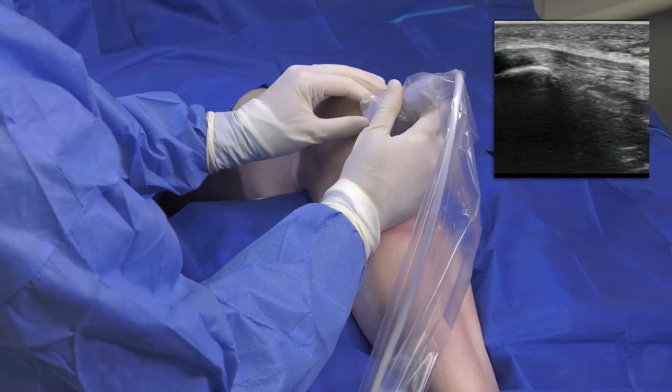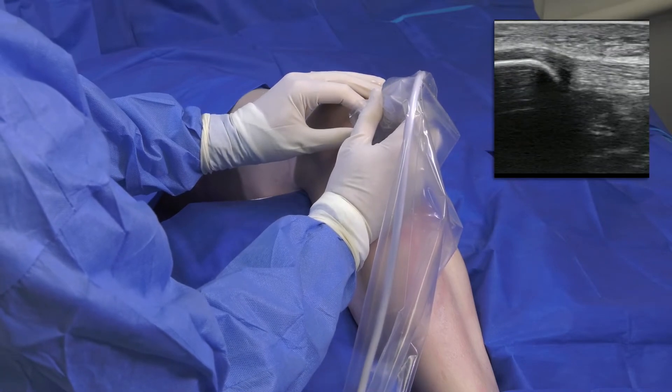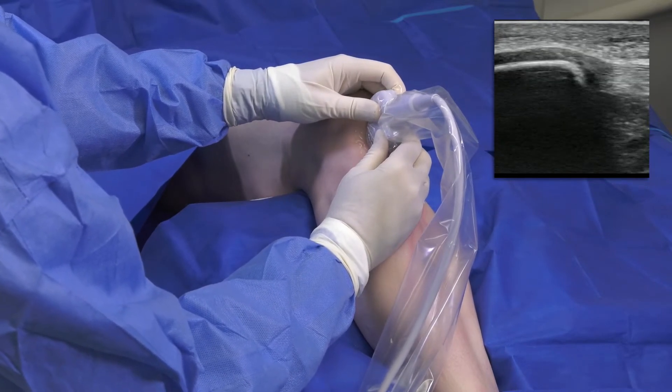I perform a diagnostic ultrasound to identify and confirm the location of the pathology, which is typically near the origin of the tendon on the patella. As you can see on ultrasound, I notice a small hypoechoic area that I will target with TenJet.